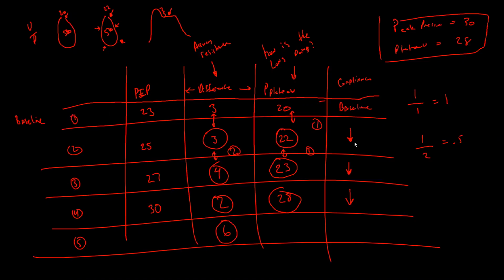So if you're closer together from where you peaked and you drop, you're getting worse, because you don't have any distance between that and that resting plateau period, correct? Wait, are you talking about this area right here? Yes. Okay, so that area right there is the difference between your peak pressure and your plateau pressure. That's your airway resistance. So if the resistance is closer together, then you're doing worse.